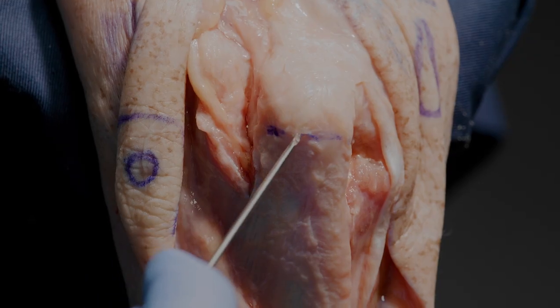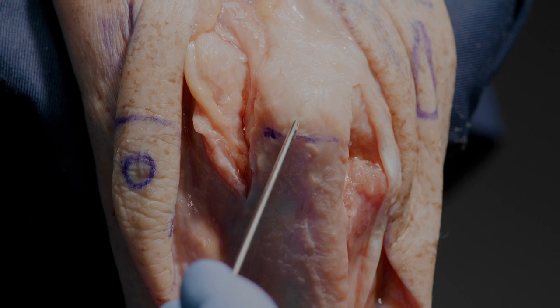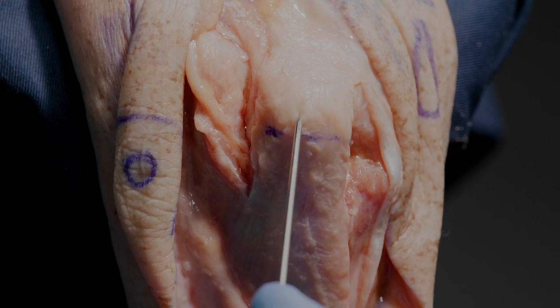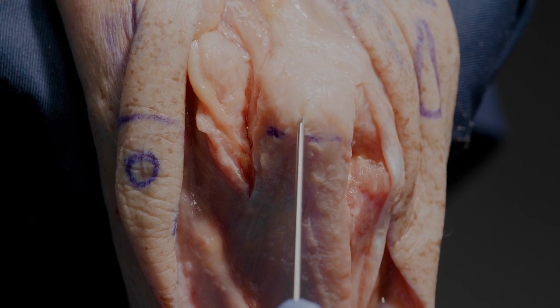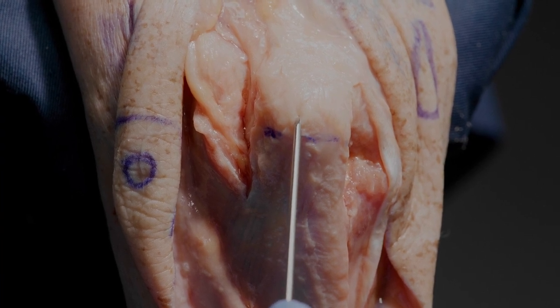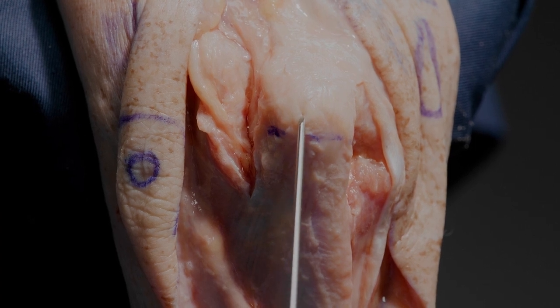The trans-olecranon osteotomy will give us about two thirds of the articular surface, with the remaining one third anteriorly still being very difficult to see. But we're now going to demonstrate a trans-olecranon osteotomy.